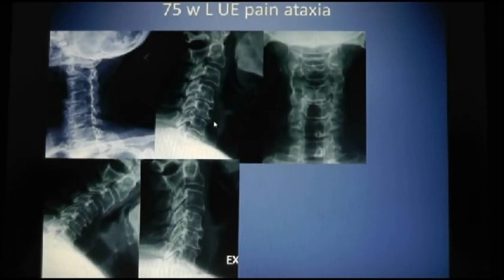And they're usually black, right? Yes. Unless they're acute, right? An acute disc herniation or protrusion is the term I would use. Well, no, but I'm trying to lead you into something.